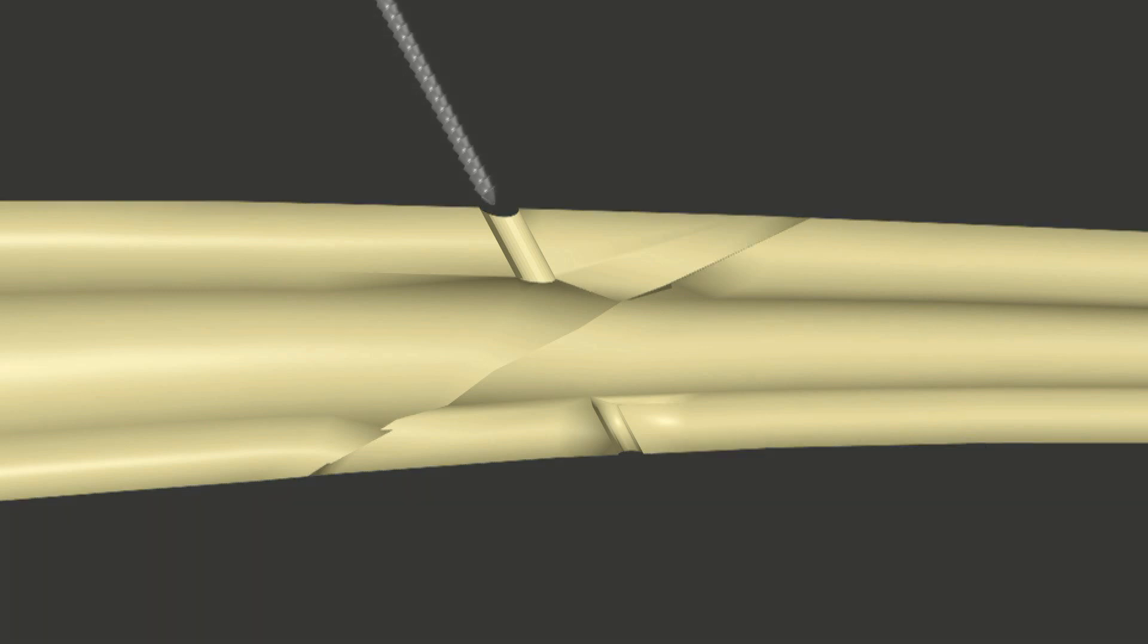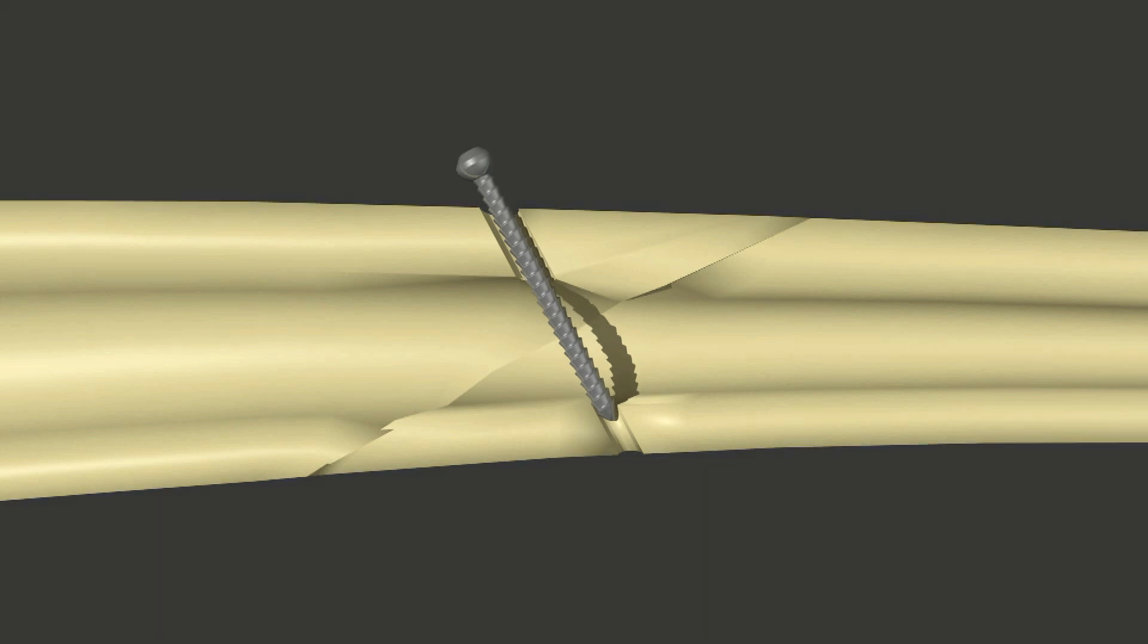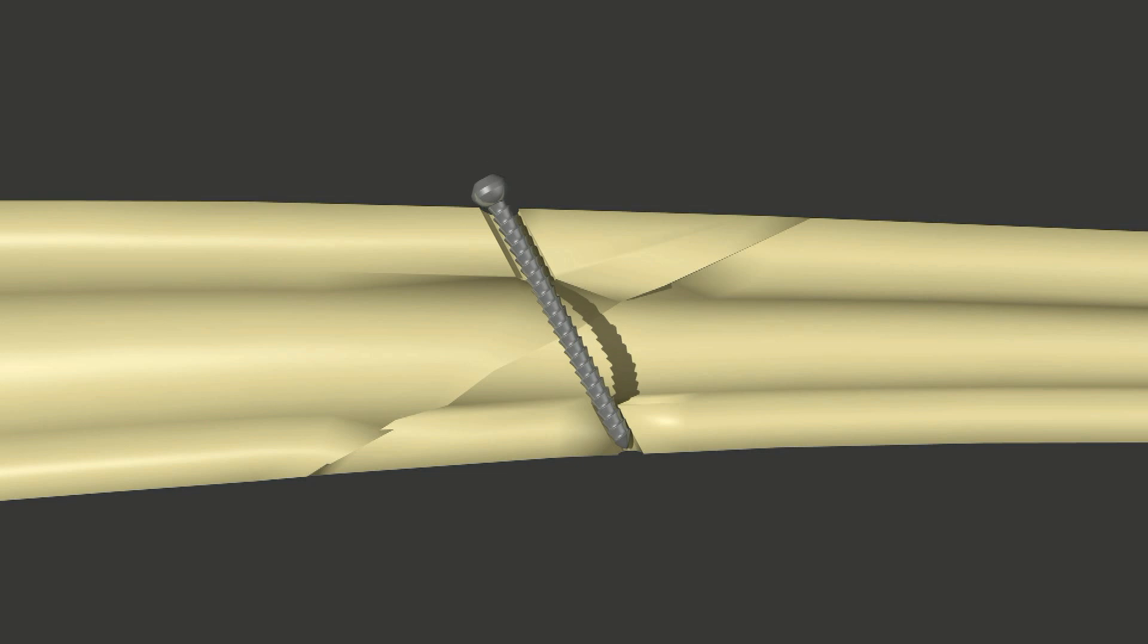The screw is then introduced into the hole. It will glide through the glide hole in the first cortex before engaging the pilot hole in the second cortex.